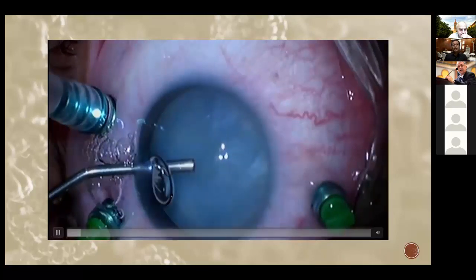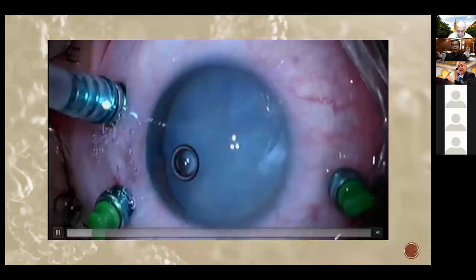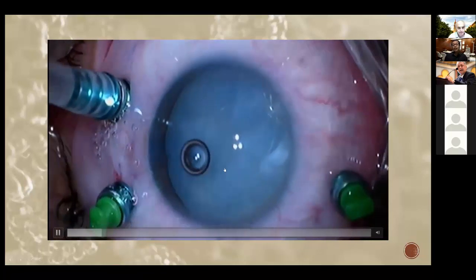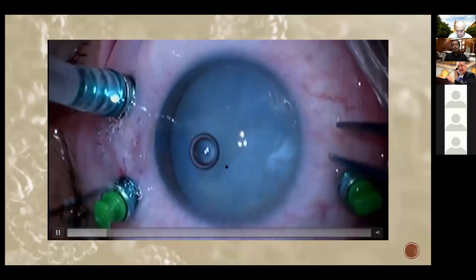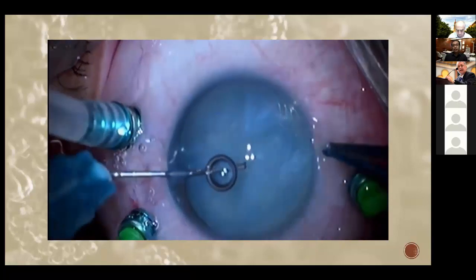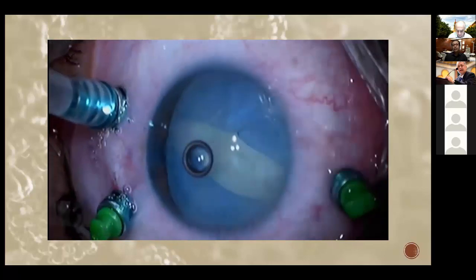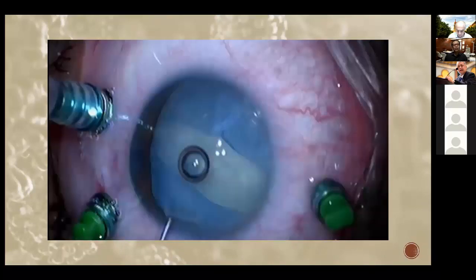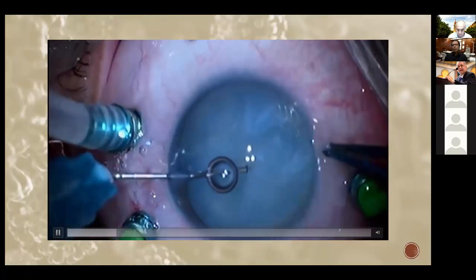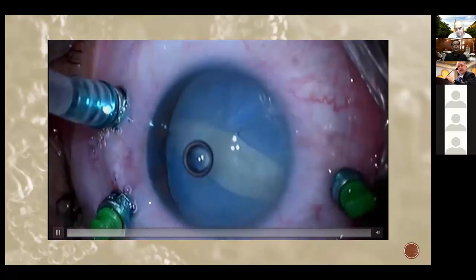What I did here is I did exactly what I do all the time. I went from the side port. I injected methyl inside the anterior chamber, and the anterior chamber was very deep. So I assumed I'm giving enough pressure in front of the anterior capsule that will equalize any intracapsular pressure. I started trying to do a rounded incision, as Dr. Yahya said, but it just didn't work. Look again. Once I punctured, I tried to make my puncture a curved one, but my curving just took it all the way, and it just ruptured.